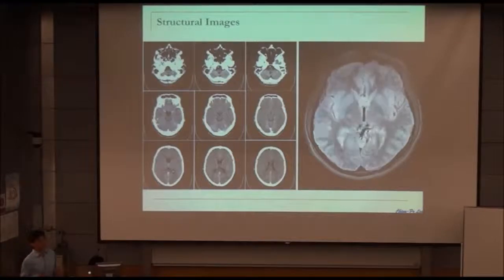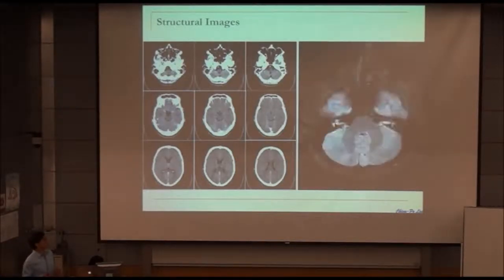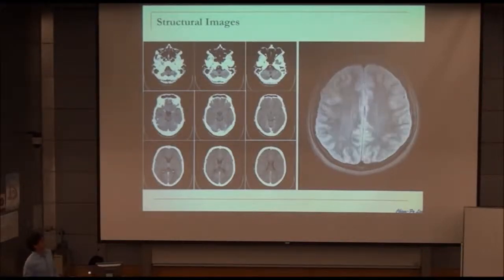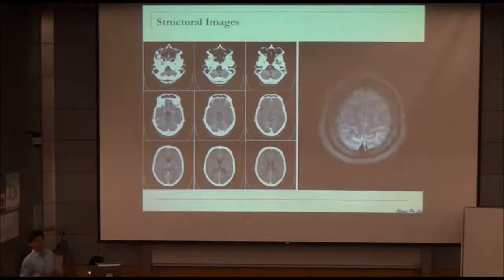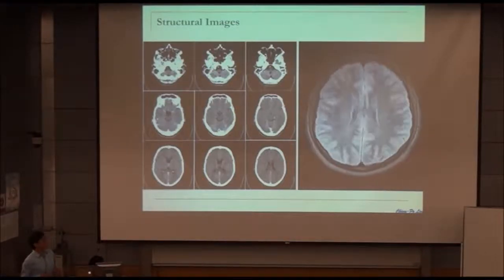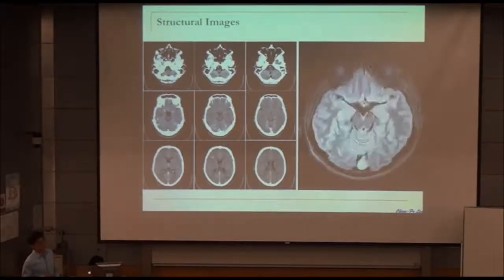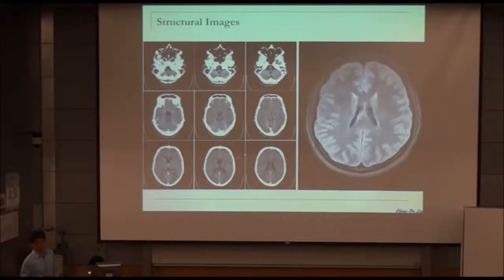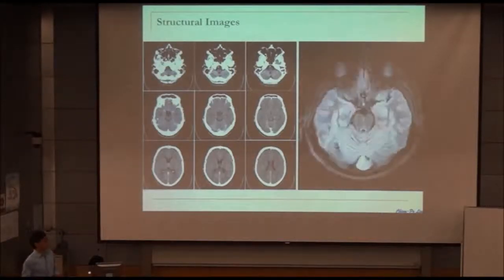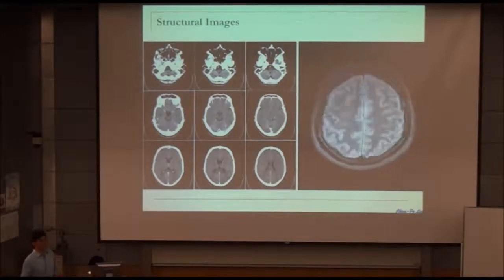Time is very, very important to the patient, so we must have some information in a very short period. But for cognitive measurement, or when we want to know the brain functions, we still don't use such a technique because there is some radiation. When you have a little scan, it's fine. One or two times per year is fine. But we can hardly have a long-term measurement, right?